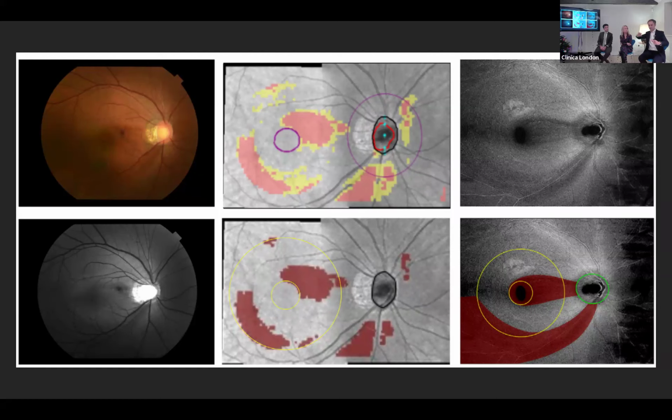So the OCT marks out where the rim is, and then from the edge of Bruch's membrane, it draws the shortest line it can to get to there. The reason we use it is that research has shown that it's the one that best correlates with glaucoma and functional glaucoma loss. This is something that's coming up. I mean, it's not available yet.